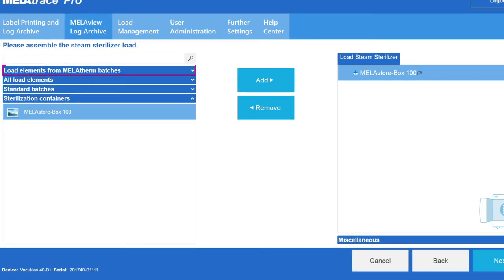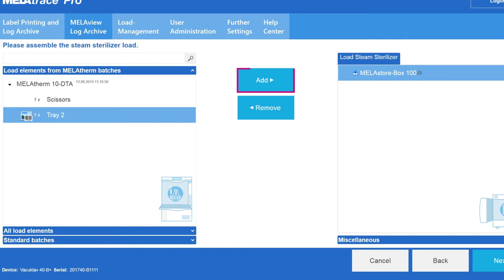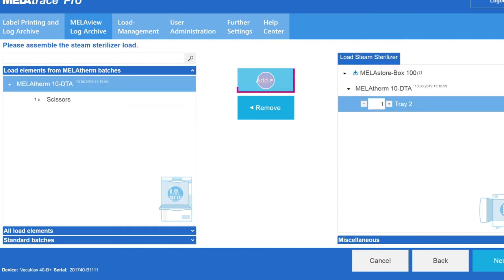To do so, please return to the Mieleferm batch. Select Tray 2 and click on Add.